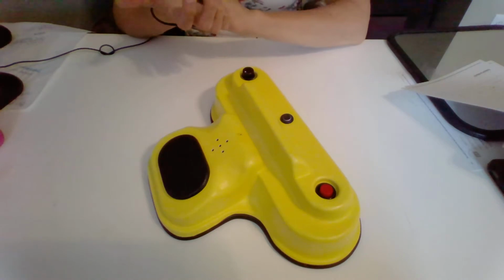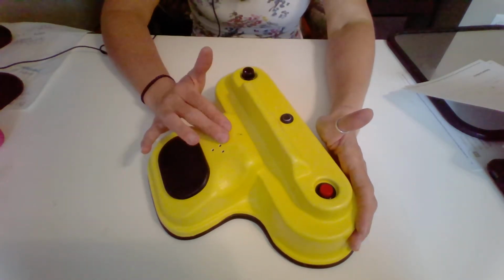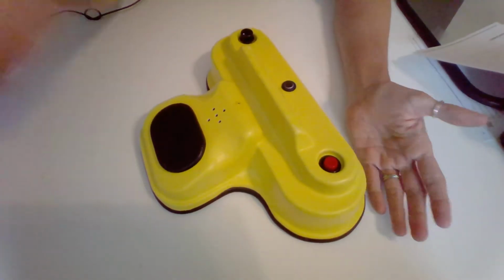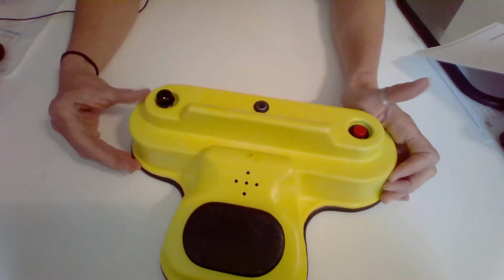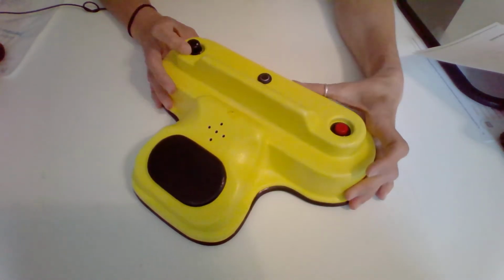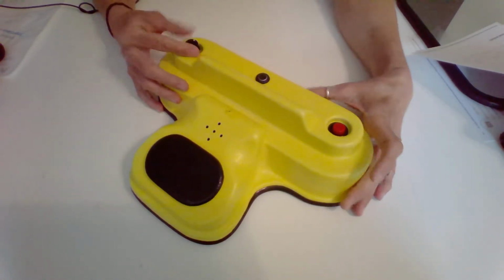So, do I think there could have been a longer recording time on that? Sure. 45 seconds, that'd have been nice. But 20 seconds is good, and 20 seconds will do you for really what you need to do most of the time. All right, let's turn that volume down just a little bit so we can see what it sounds like when it's lower than high. We'll turn it like halfway.